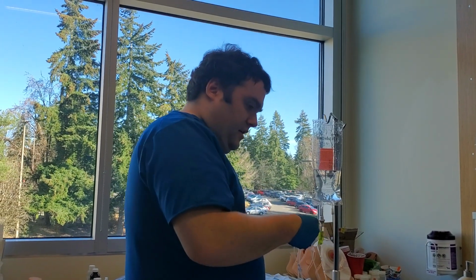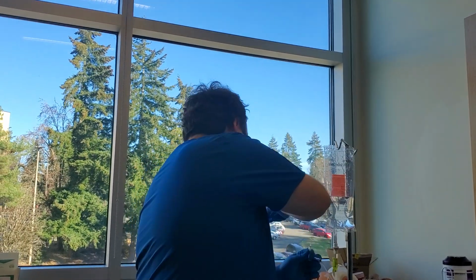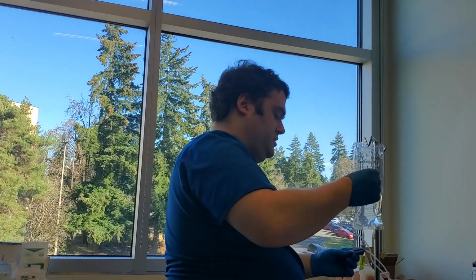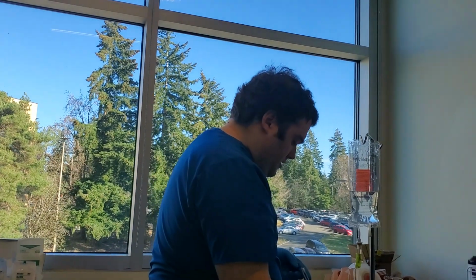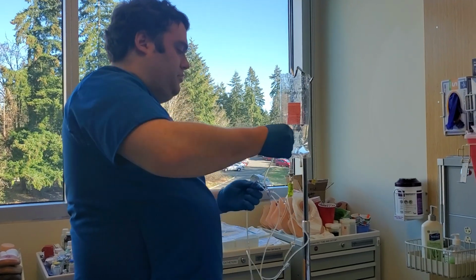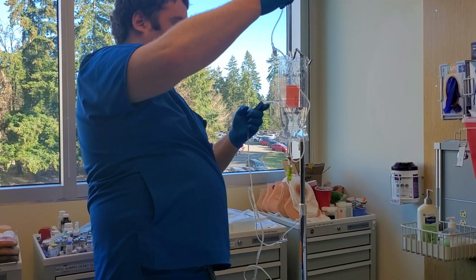Take the cap off here. And then we've been checking for any air bubbles. We can maybe let it run a little bit, or we can also raise it up this way to get them out. And so say there are none.